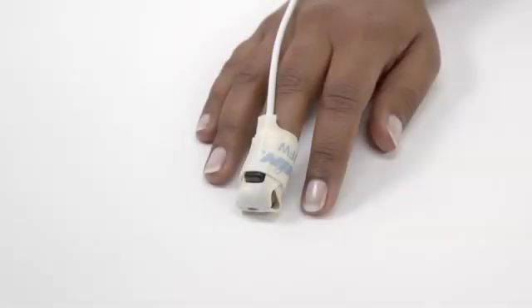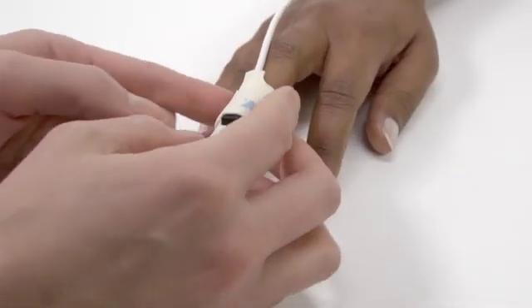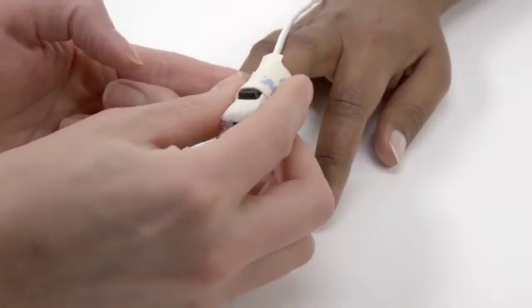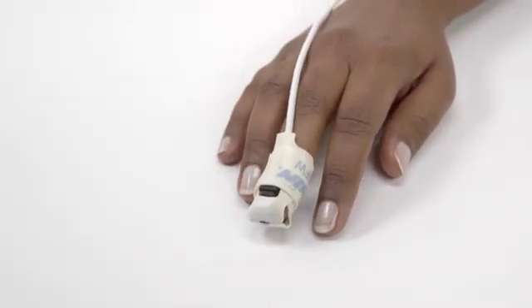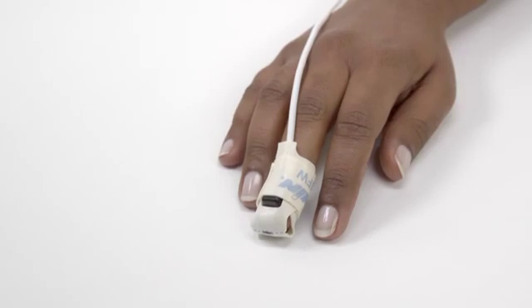Check the sensor position and connection every six to eight hours or per your institutional policy. Also check for skin irritation and loosening of the adhesive from movement over time.